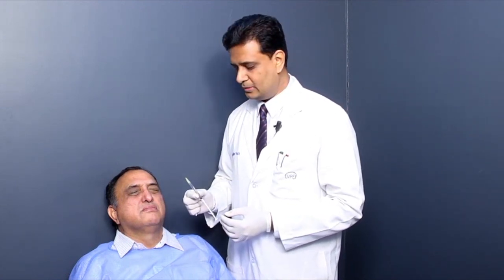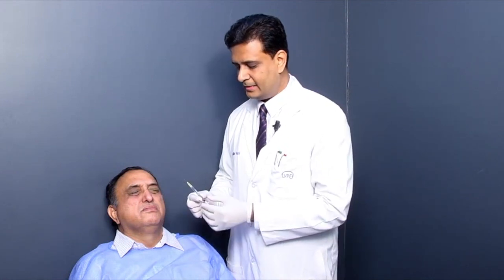We are now going to inject Mr. Basavraj with Botox. Prior to the injection, I have loaded the Botox into a 1ml tuberculin syringe with a 30 gauge needle. Before I begin, I make sure that the hub of the needle is in line with the markings of the syringe so I can see how much I am injecting. It is very essential to doubly check that the needle is firmly pressed into the syringe and not loose, and I would prefer to have my thumb ready on the piston of the syringe.